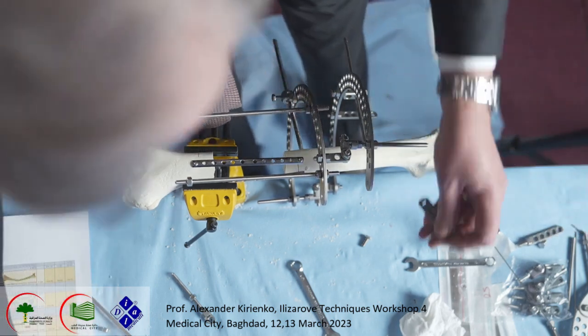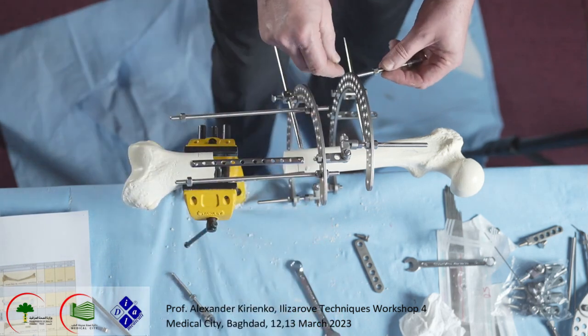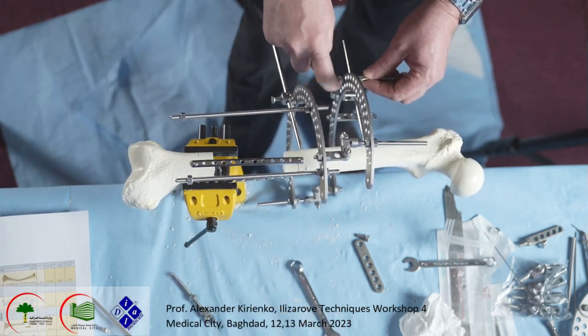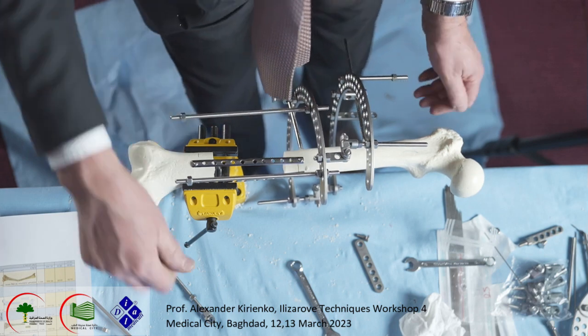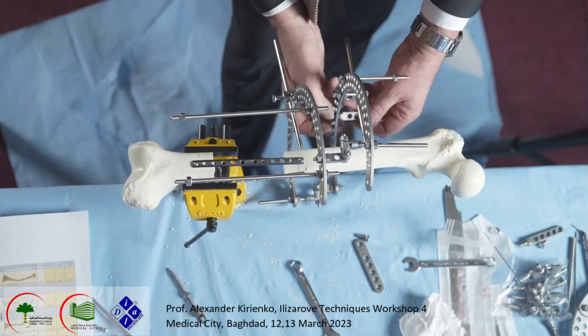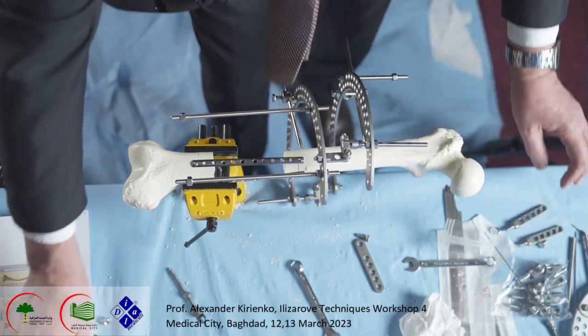Okay. Another rod, same length, 100. This.